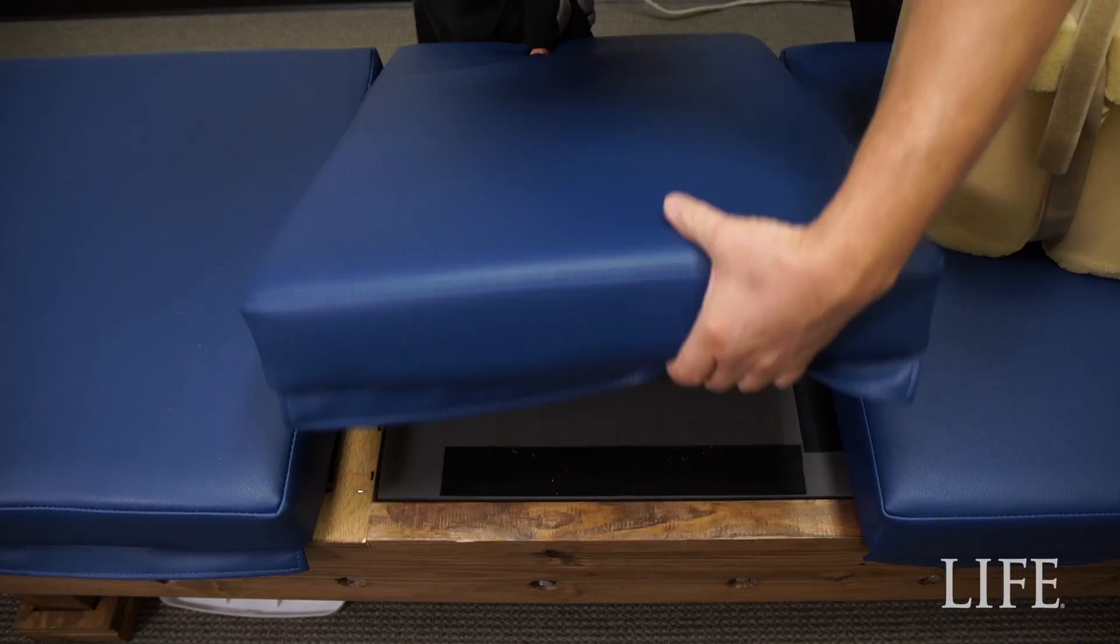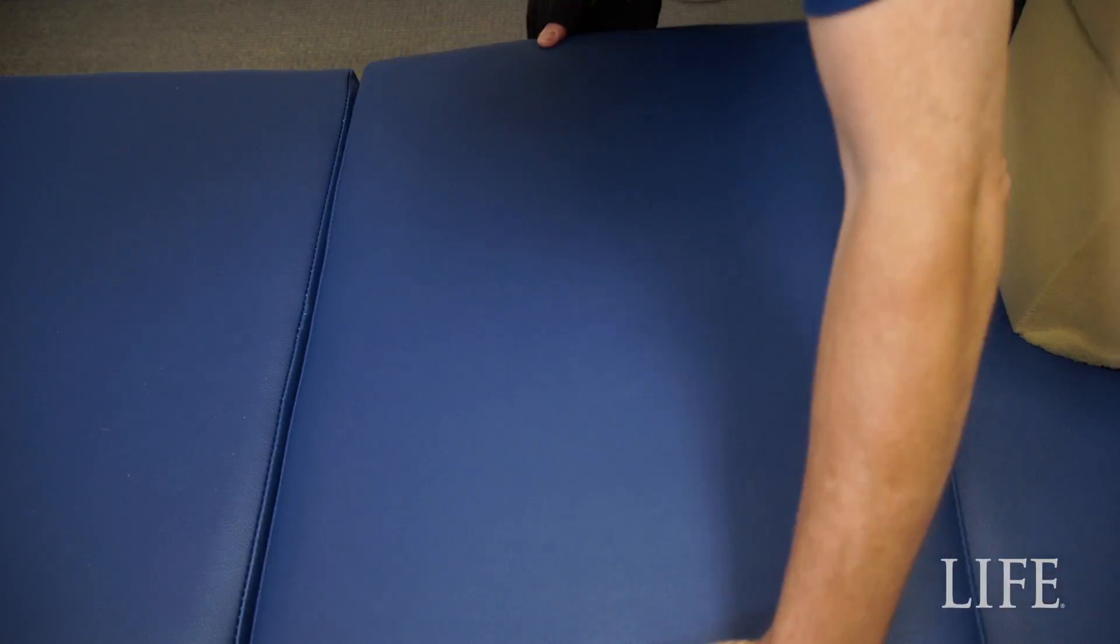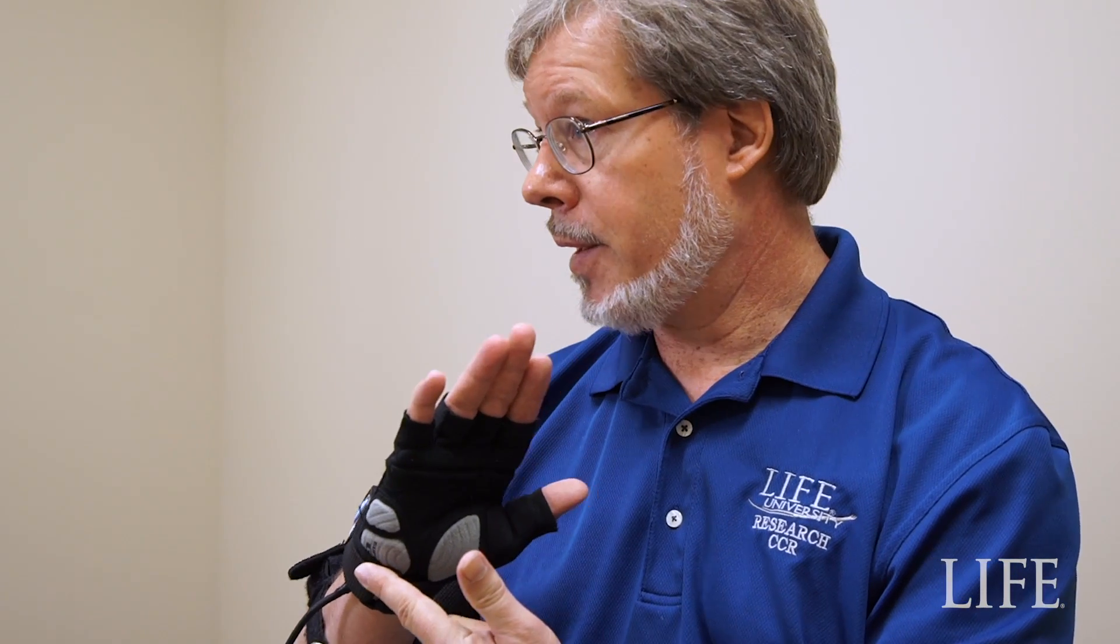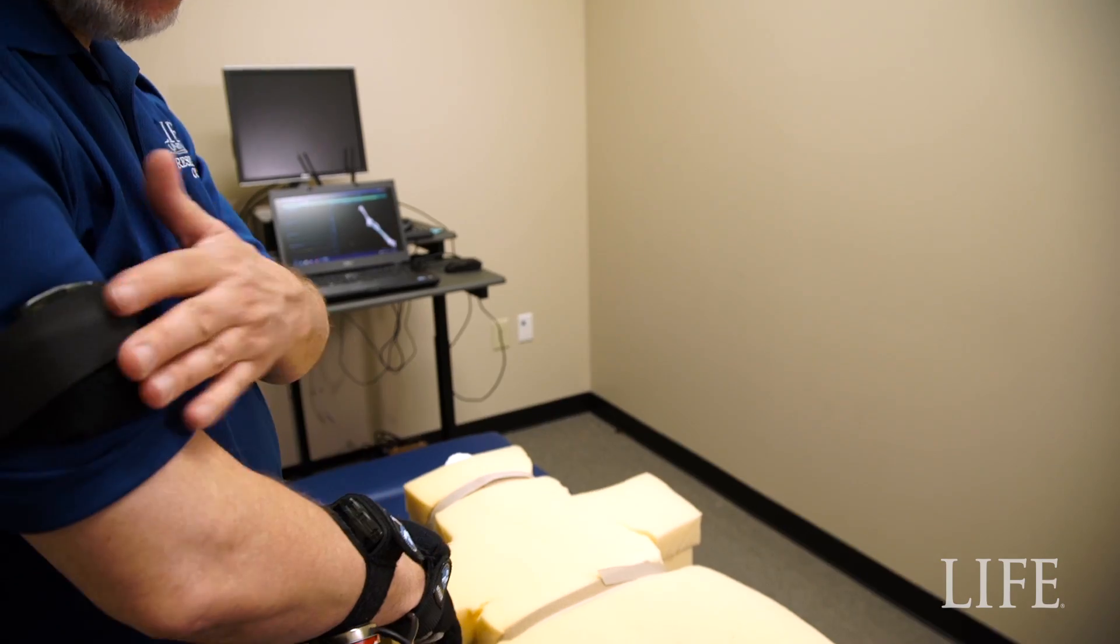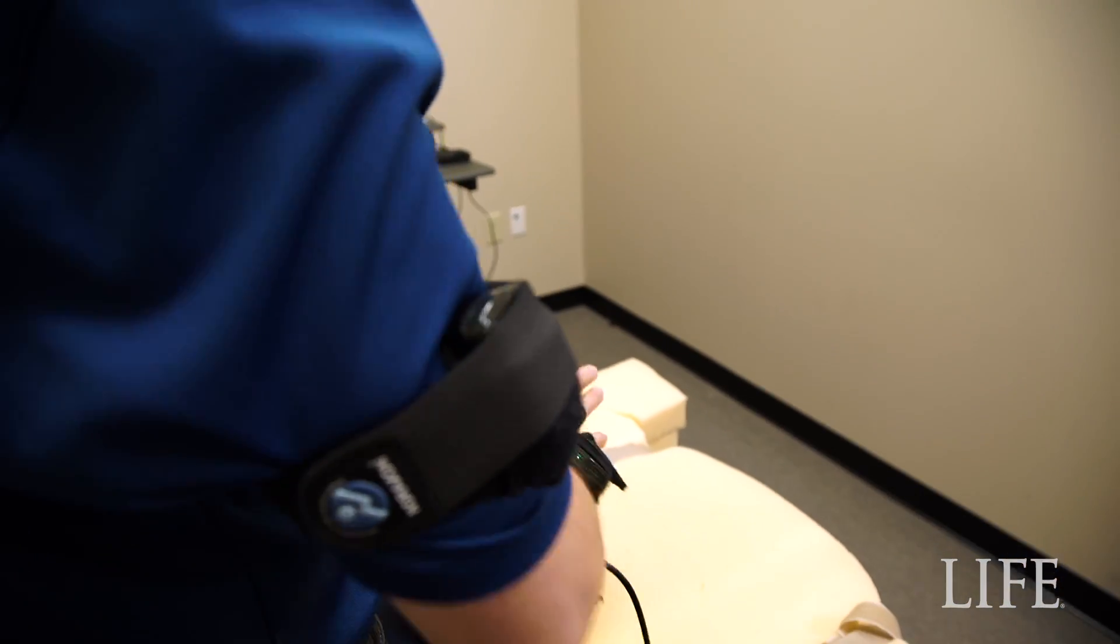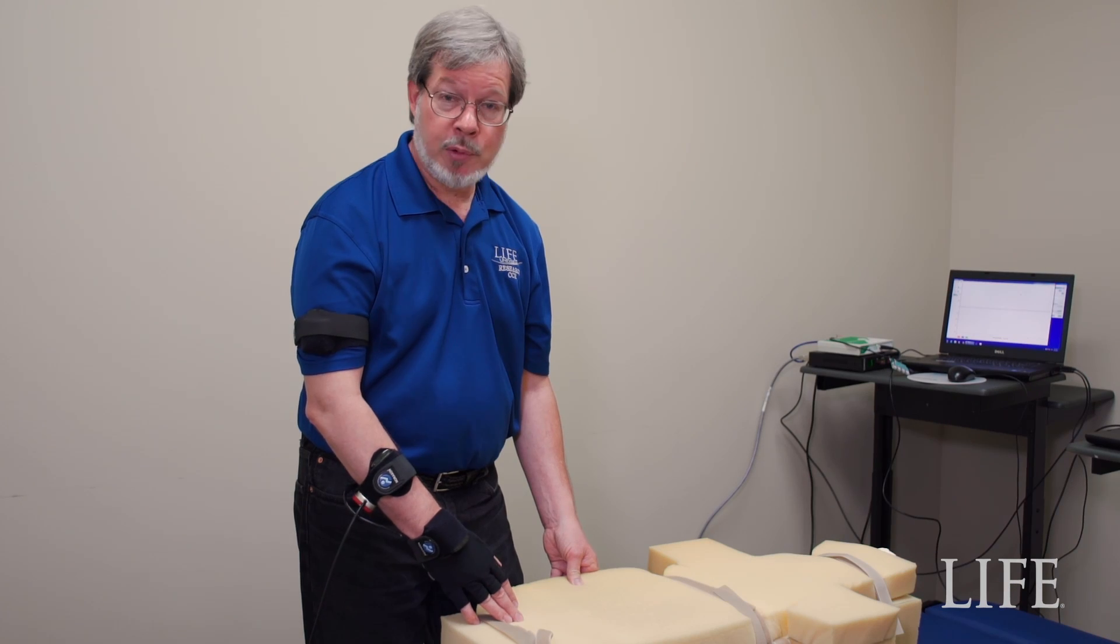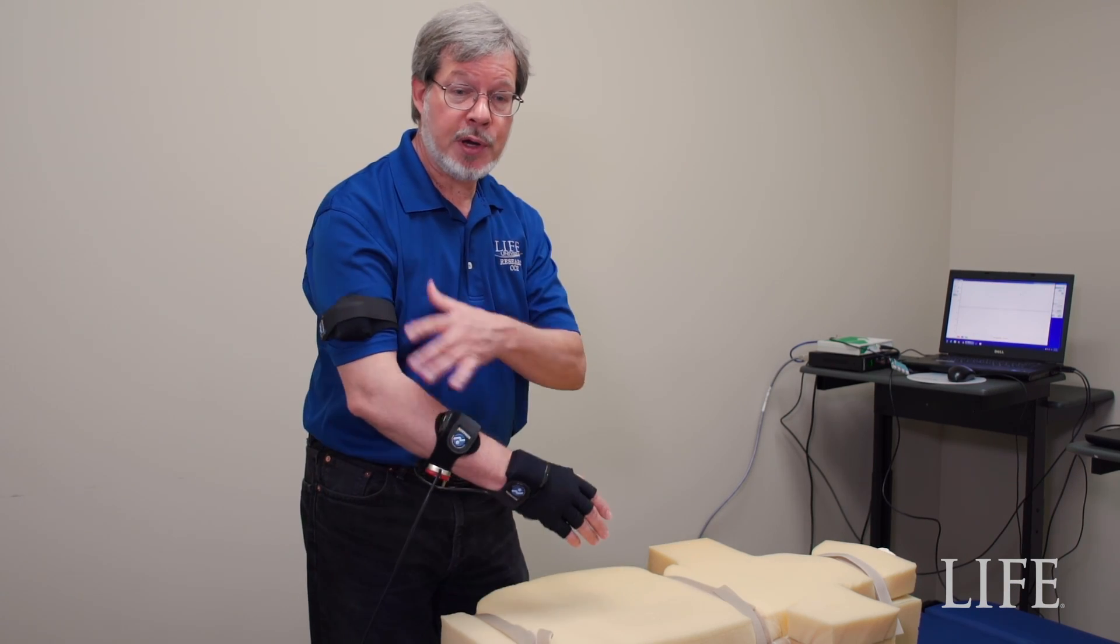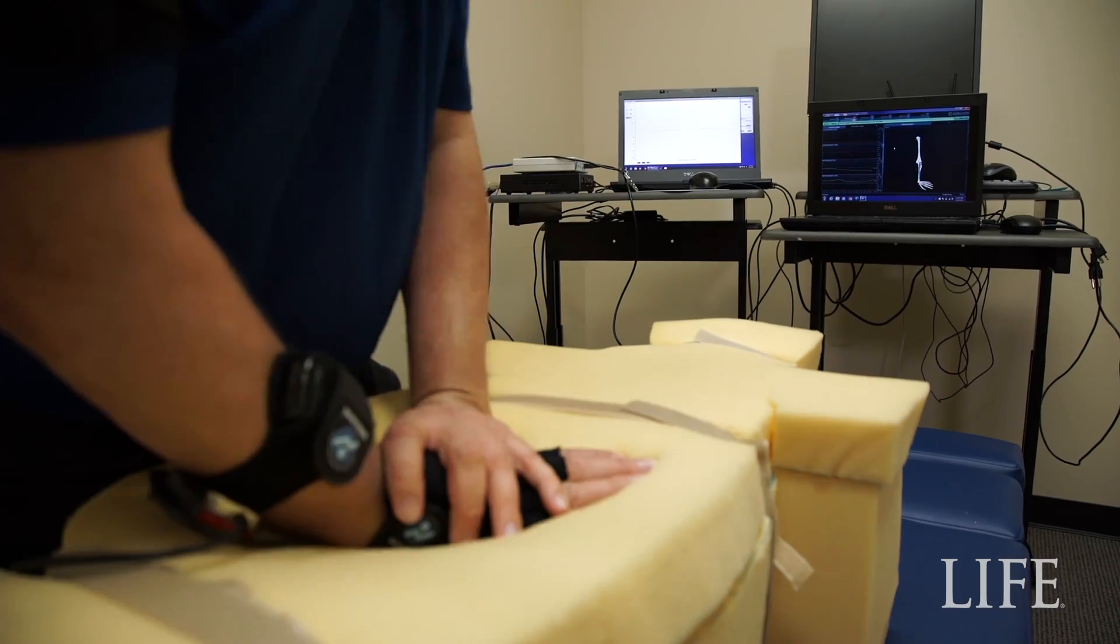This is sort of a ten thousand dollar bathroom scale that measures forces in three dimensions. We're developing a system where we can measure the amount of force coming out of the hand with this glove. We can measure the direction that the hand, forearm, and arm are moving in while performing a thrust, so we really have four systems at once: force in the hand, motion of the arm, force into the table, and direction of the force in the table.